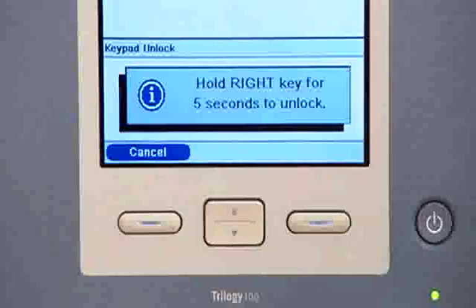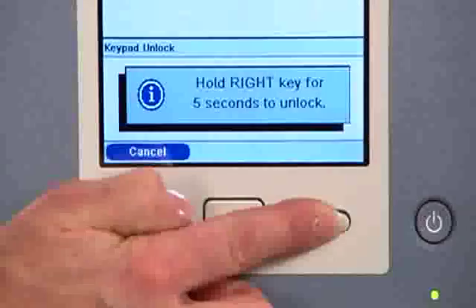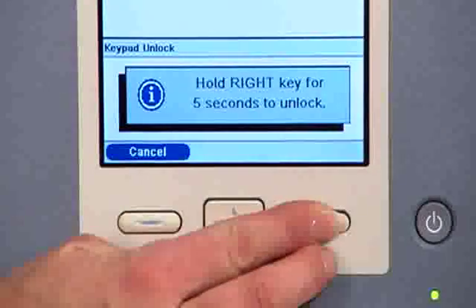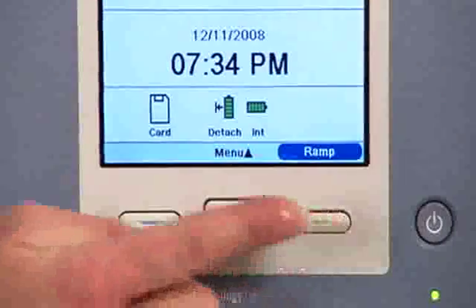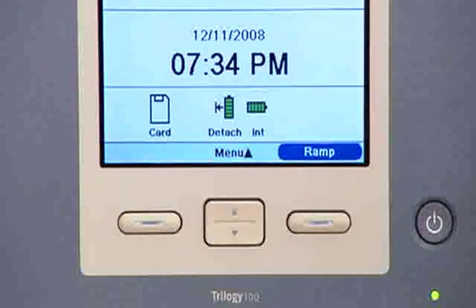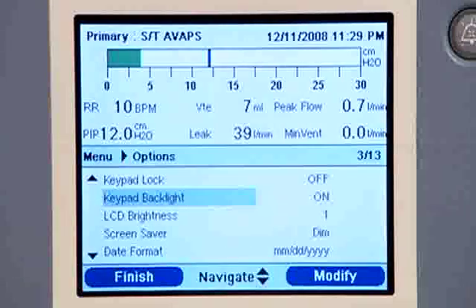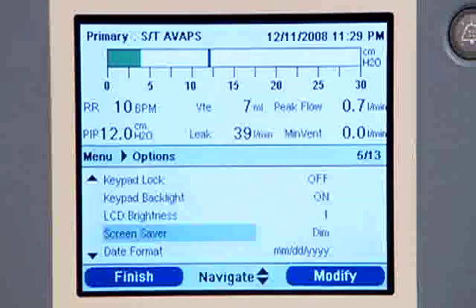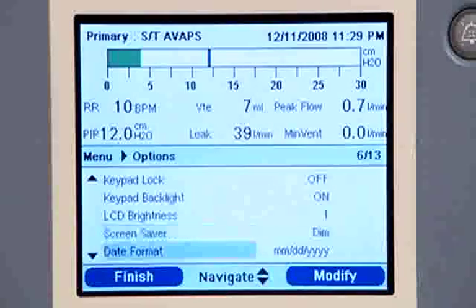You can temporarily unlock the keypad from the monitor screen by pressing any of the locked buttons. A directional message will appear. Follow the directions on screen, which tell you to hold the right button down for five seconds. When the keypad is unlocked, an audible confirmation indicator sounds and the on-screen buttons on the display reappear. Other items on the options menu include keypad backlighting, LCD brightness, screen saver, and date display.